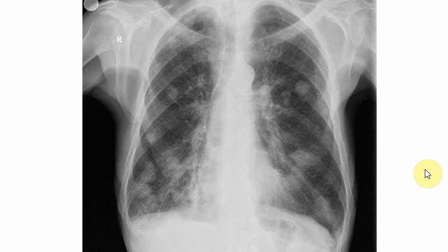So these few x-rays show some very common findings you can find on x-rays, besides obviously broken ribs, pneumothorax, fibrosis, and different types of pneumonias. These are the important common pathologies on x-rays. Thank you.